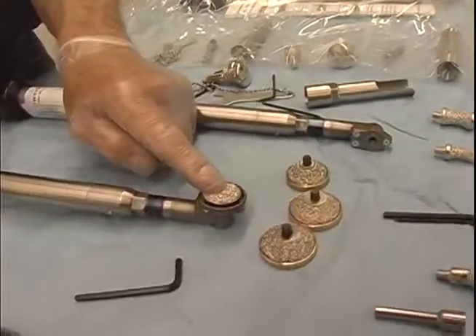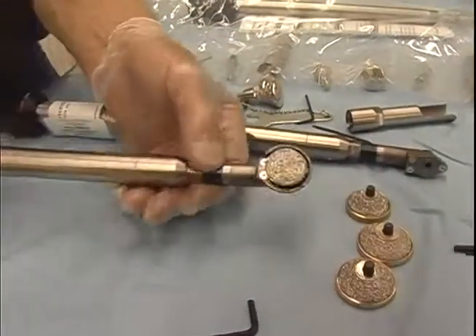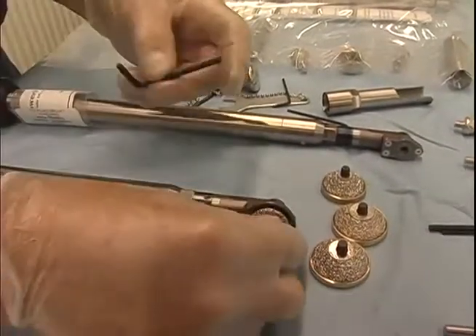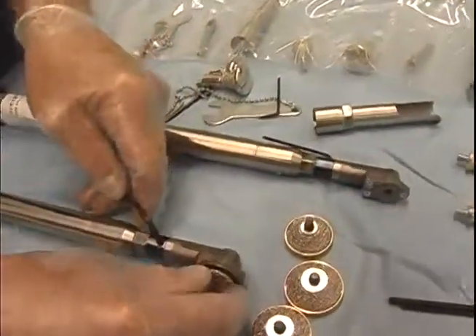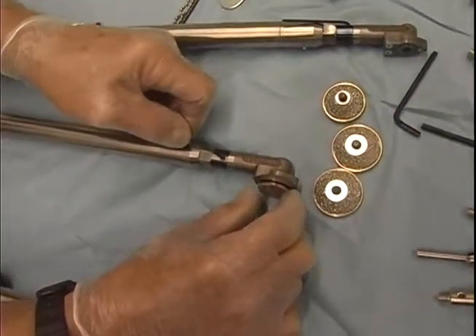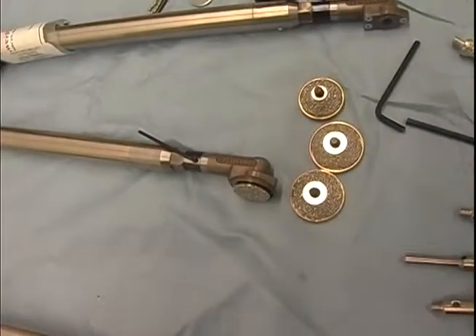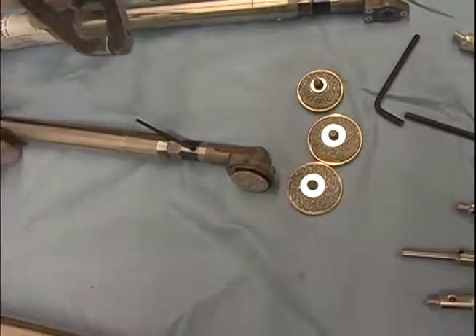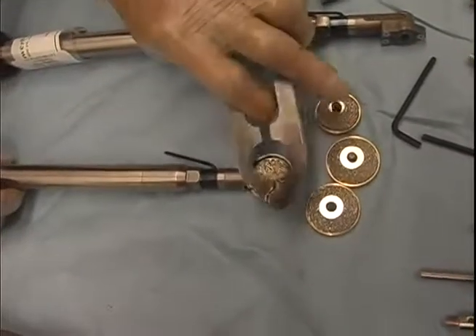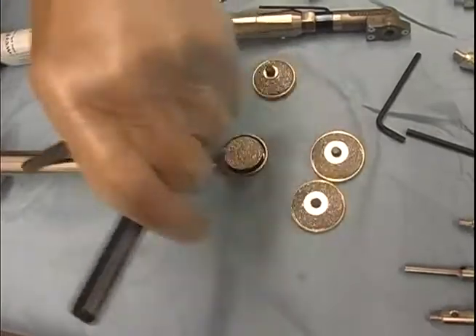In order to remove the flat grinding disc on the guarded right angle, it's a similar procedure. We simply find the opening into the shaft, then we lock the shaft, turn the wheel to lock the shaft. Now it's locked, and we have a wrench that will grab over top of the grinding wheel, and you simply just unscrew it.